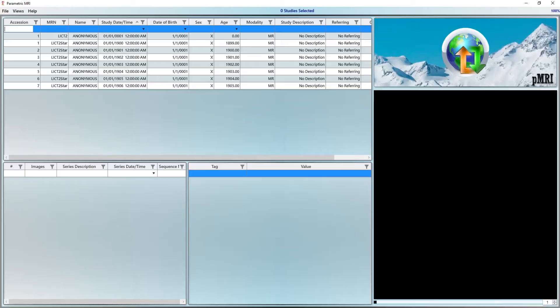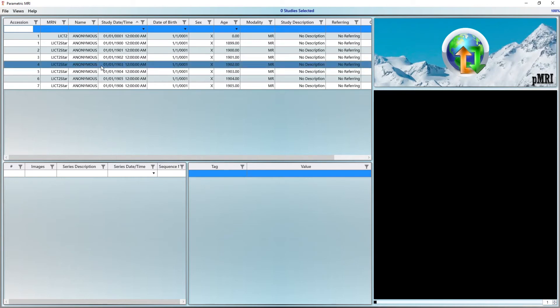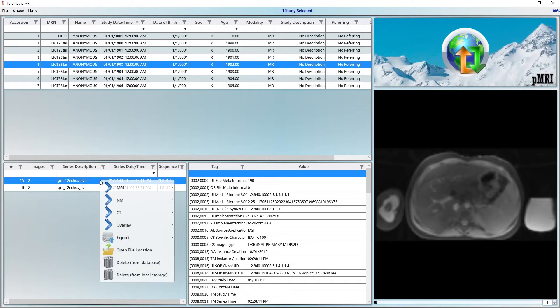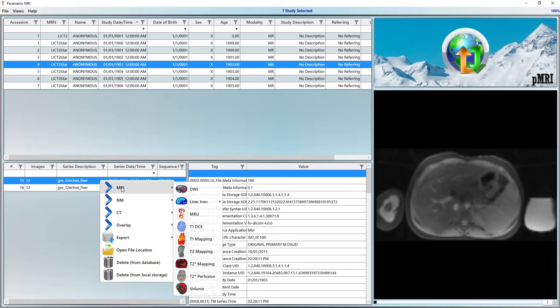Let's begin. First, we import a case, either from PAX or local storage. Both of these options are covered in another video. We find the correct study, right click on the correct series, the multi-echo gradient echo T2 star sequence, and select T2 star liver from the list of options.